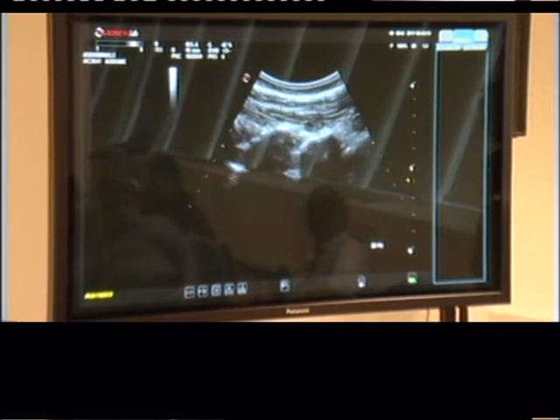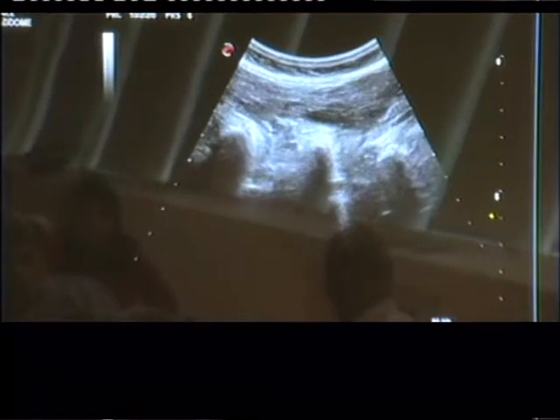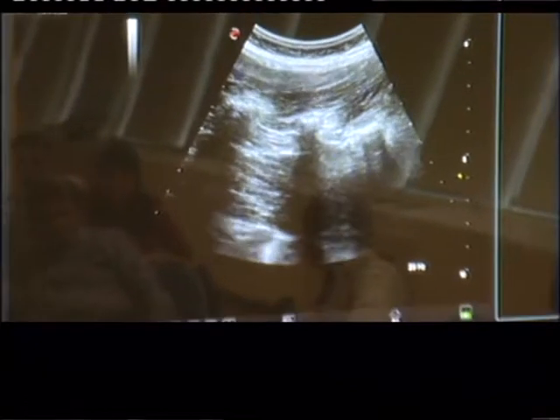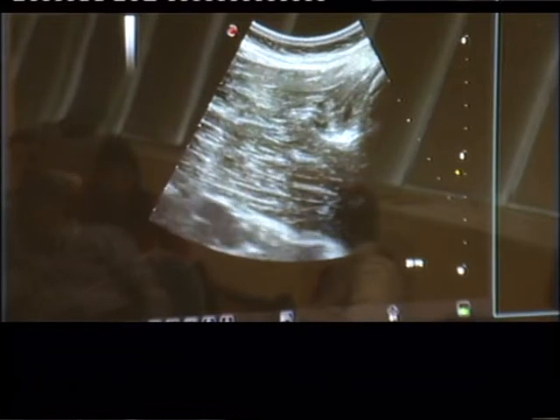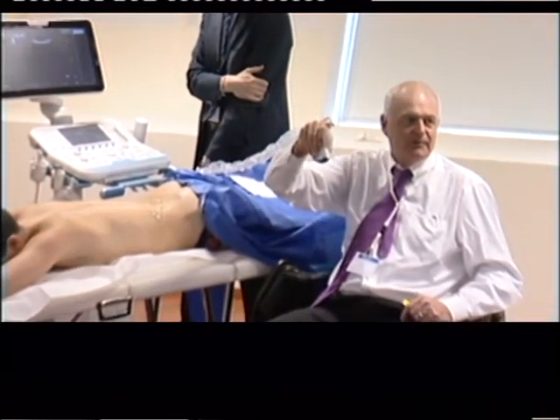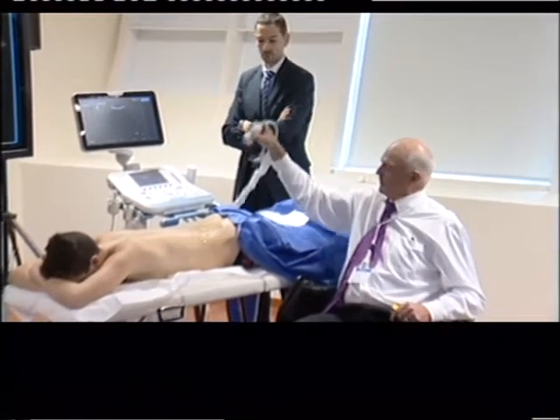We have lamina, facets, nerve roots, transverse processes. And if we go farther, no more transverse processes. The bone is finished. So the thing is when there are no transverse processes, nerve roots, facets, and an epidural space. Okay?